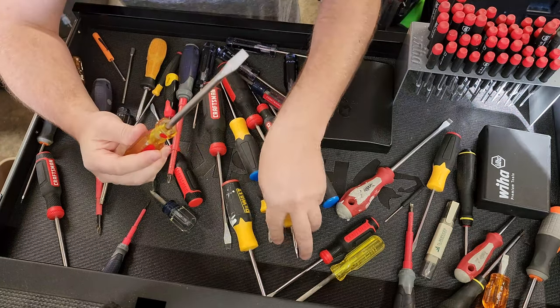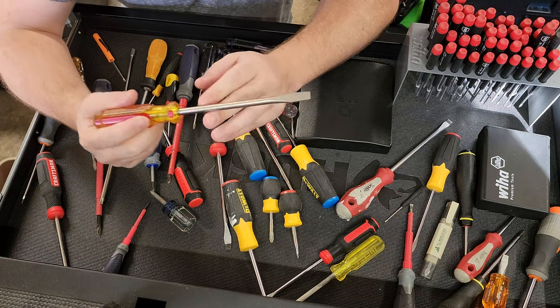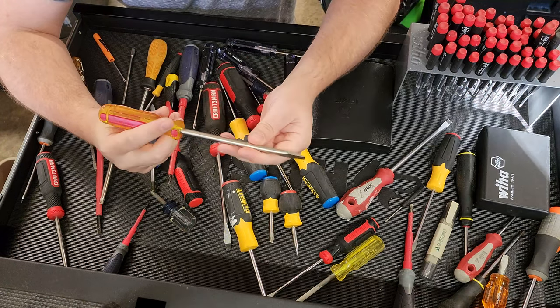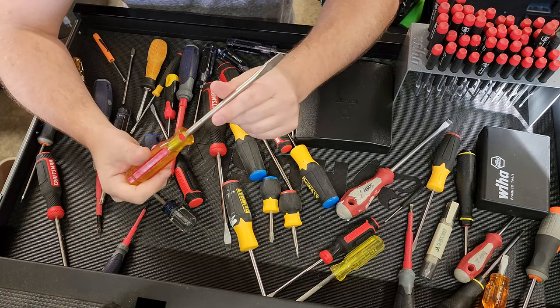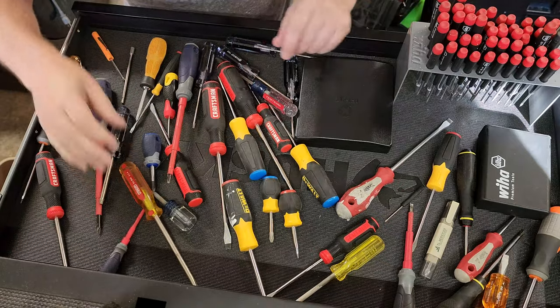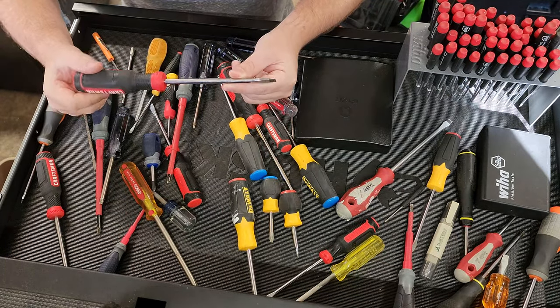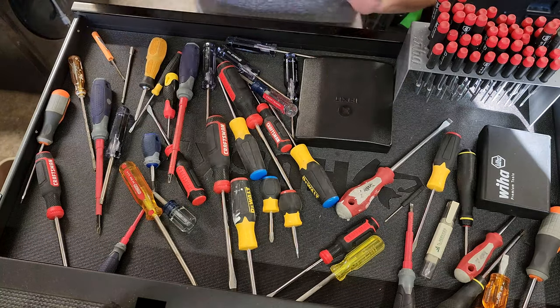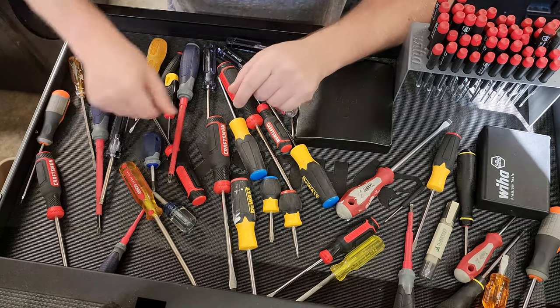Now what do you think a large flat blade screwdriver like this could possibly be used for? It's long been said that flat blade screwdrivers are not pry tools, but almost any good biomed I know thinks of these ones right here as the ideal pry tool size. So flat blade is your main one but it's not the most common — it's the oldest one.